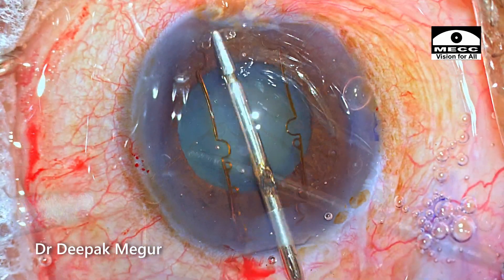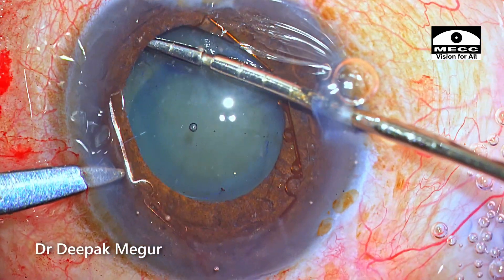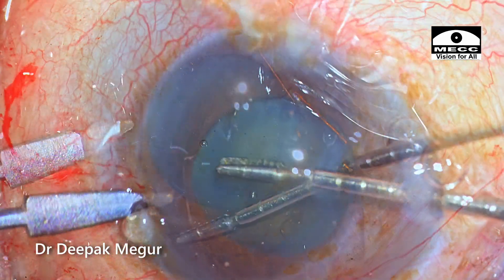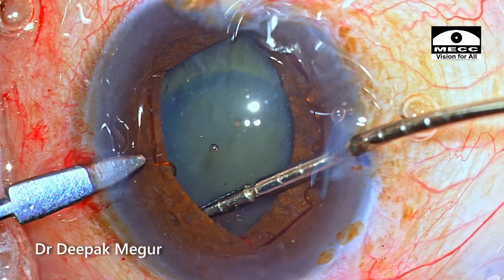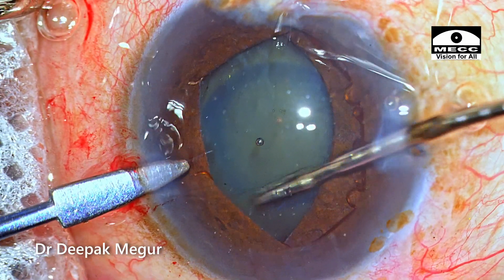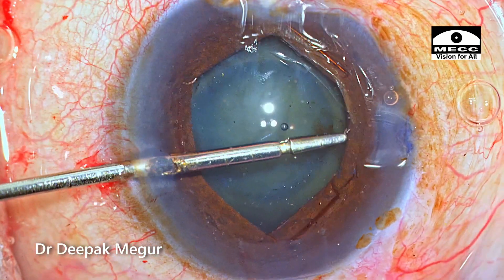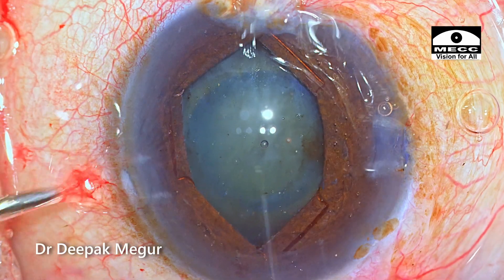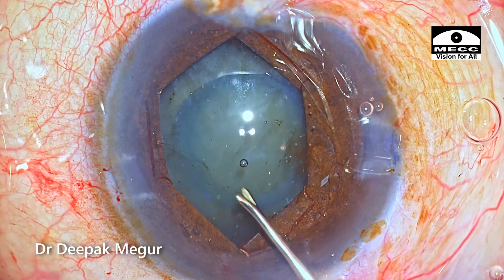Time to insert the B-hex ring. The globe is stabilized with my second instrument at the side port, and the first two pairs of notches are engaged onto the pupillary margin. The hands are switched. The final pair of notches of the B-hex ring are engaged into the pupillary margin. We have a decent opening of about five and a half millimeters, which should suffice.